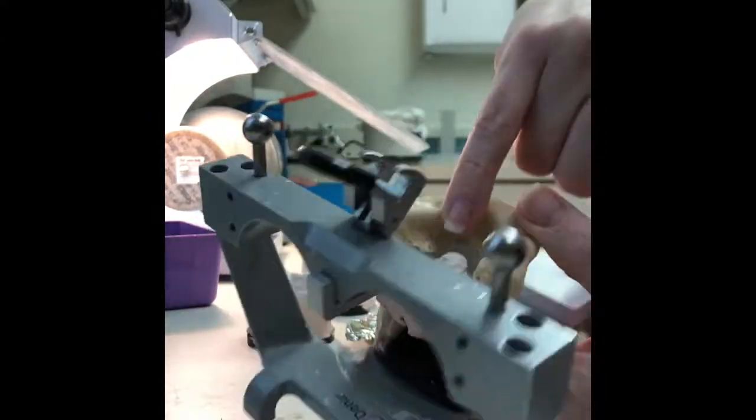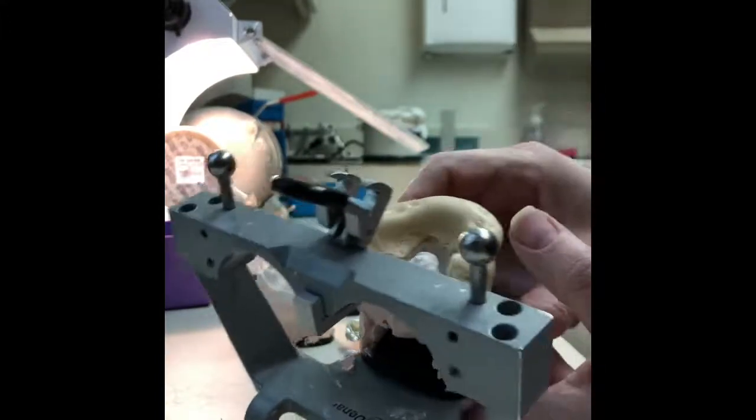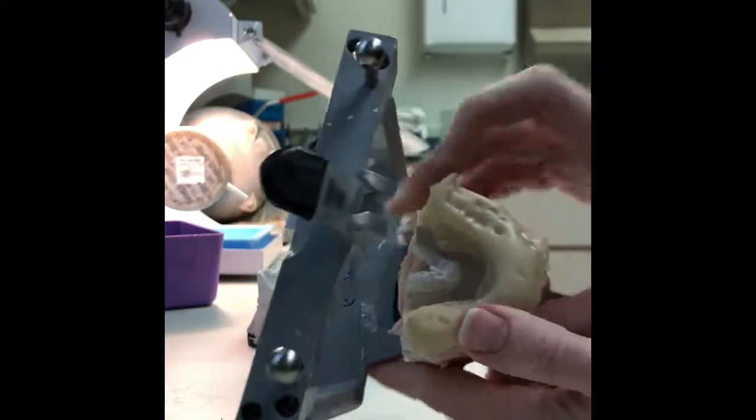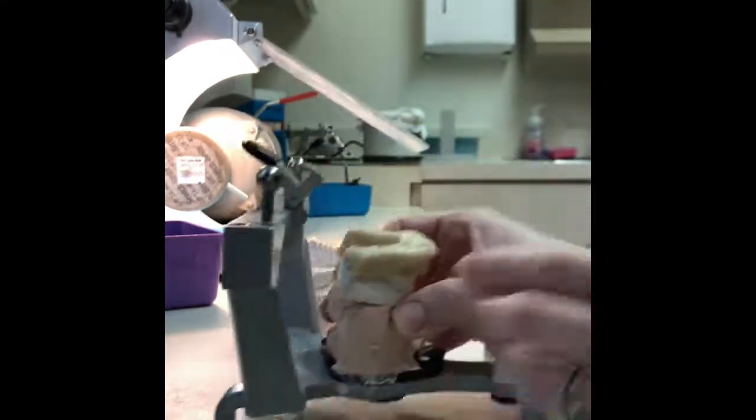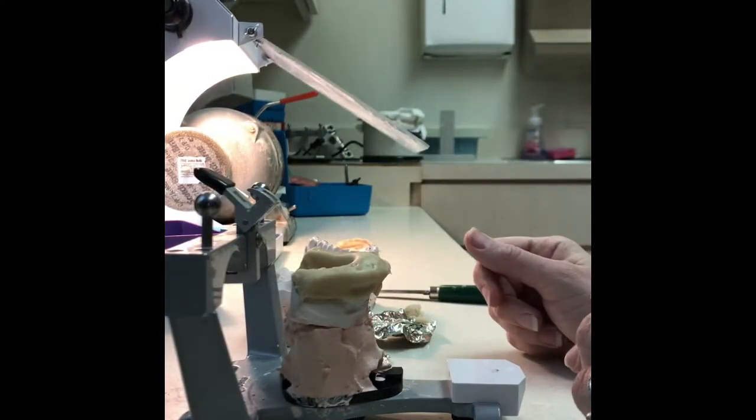It absolutely covers all those marks that we had made on the cast. It's a little long there. It's definitely really thick on the inside. I don't know if you can see that from the inside. It's really thick in through here. So we'll trim that back down, and I'll show you what it looks like.